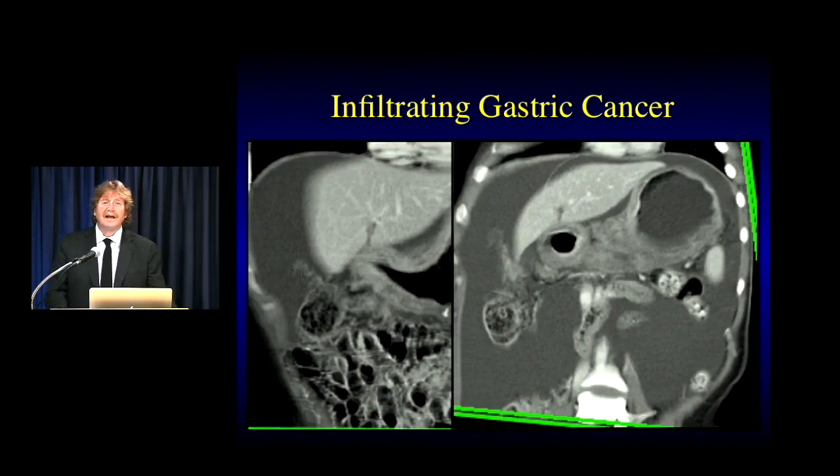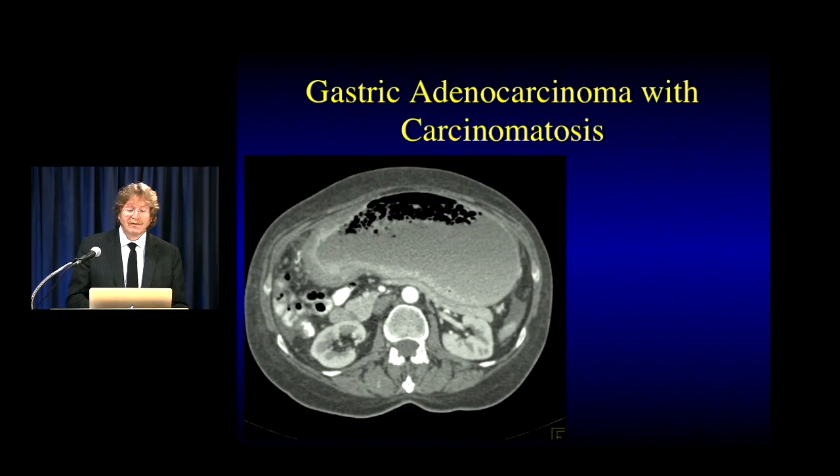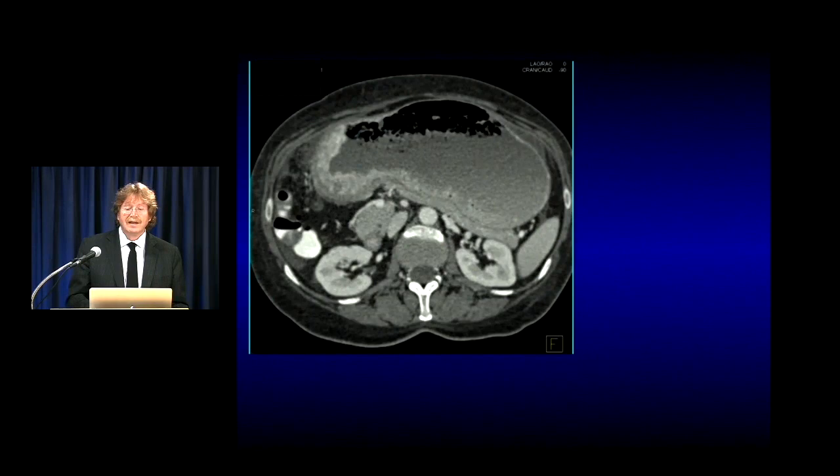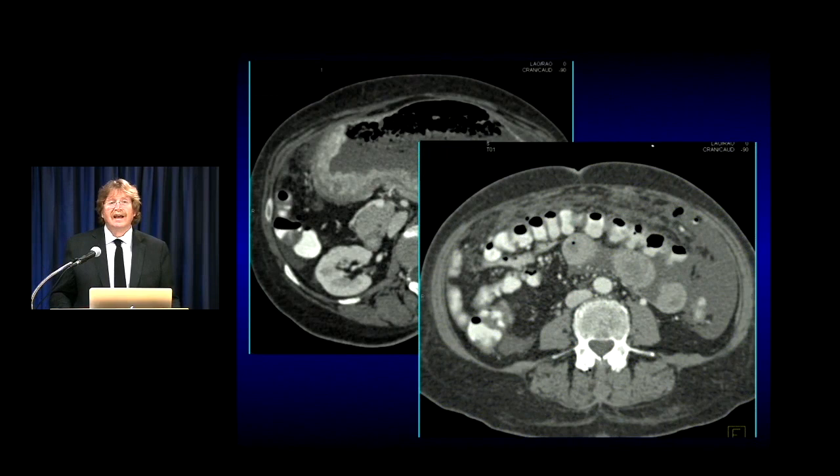We also note infiltration of the stomach — linitis plastica — with ascites indicating carcinomatosis. Ascites and carcinomatosis are common findings. In one case: gastric outlet obstruction, distended stomach, infiltration of the antrum, carcinomatosis, implants on the omentum, implants on the colon — very classic carcinomatosis. Gastric cancer is one of the classic tumors that gives this type of carcinomatosis.